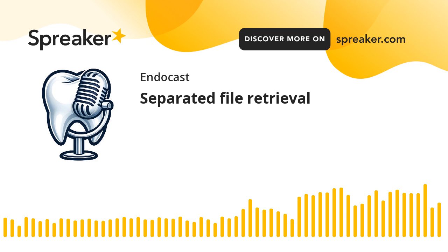They just introduce their ultrasonic tip trying to vibrate, and most of the time, and I think you'll agree with me, they are doing a lateral root perforation beside the separated file on the outer wall. Simply the tip of the ultrasonic will go outside, making a false path.